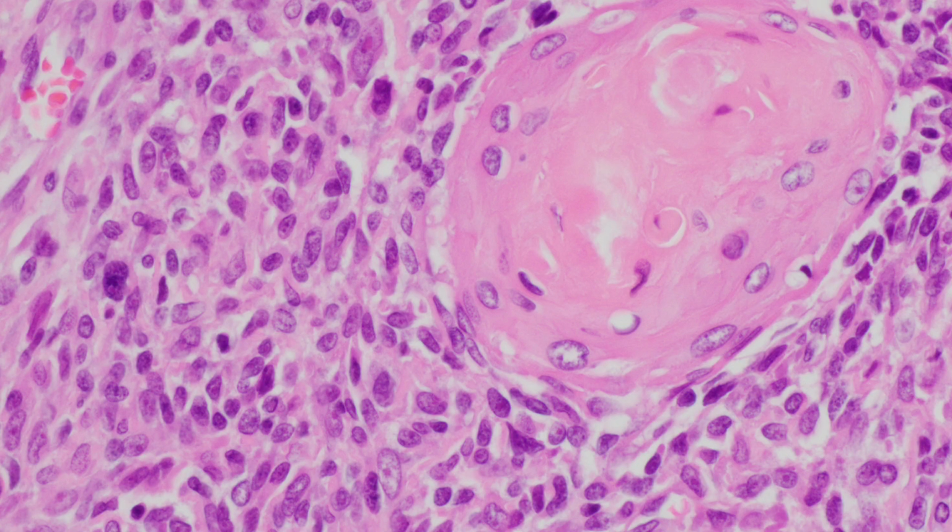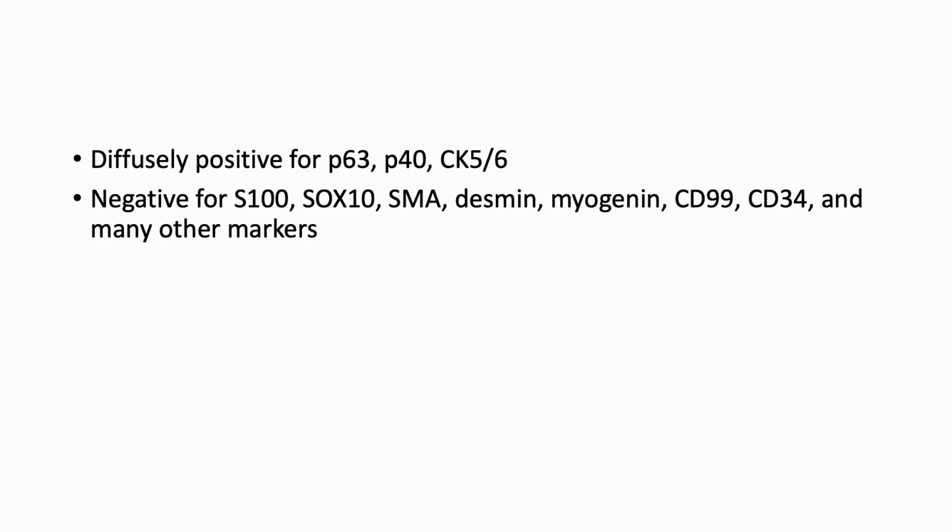mitoses or necrosis. Immunohistochemical studies demonstrated diffuse positivity for squamous markers, P40, P63, and CK5/6. All other tested markers, including S100, SOX10, desmin, myogenin, CD99, CD34, and many others, were negative. Morphologically, the tumor has squamous differentiation. Immunohistochemically, it stains like squamous cell carcinoma.